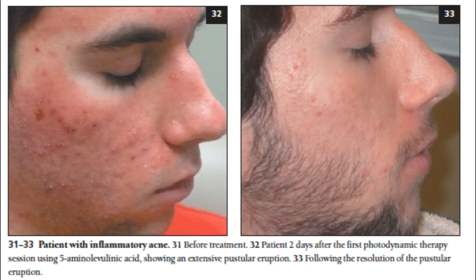While histological examination of biopsy specimens confirmed a decrease in the size of the sebaceous glands following treatment and demonstrated reduced perifollicular inflammation, the current knowledge of the potential mechanisms of action of these devices in the treatment of acne vulgaris is very limited. Treatment specifics.